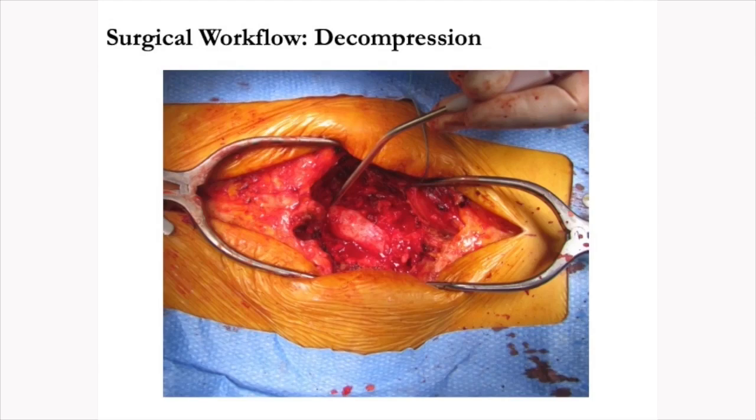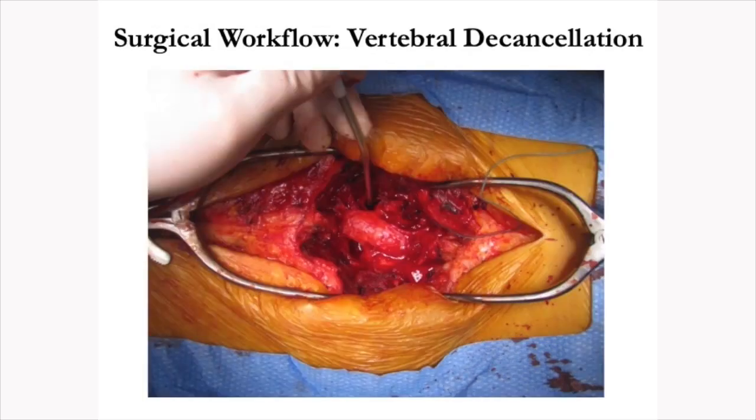Surgery then proceeds in standard fashion, with liberal central decompression above and below the osteotomy site, with bilateral facetectomies and skeletization of both exiting and traversing nerve roots. Following this, the transverse processes are disconnected from the lateral vertebral wall. Subperiosteal dissection along the lateral body is then carried out ventrally and maintained using cottonoids or specialized retractors.